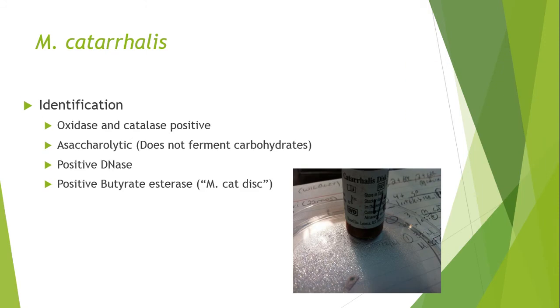How do we identify it? Well, we're going to do our rapid test. Since it's a gram-negative cocci, we want to do a catalase and an oxidase, and it's positive, just like your Neisseria.